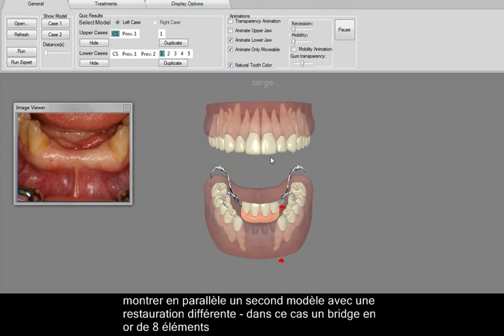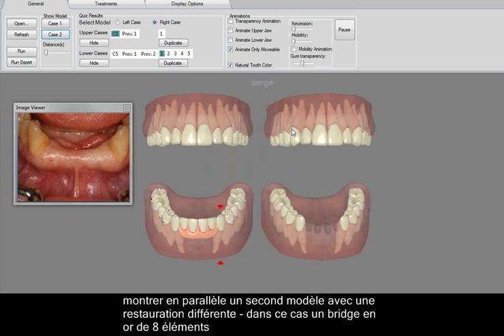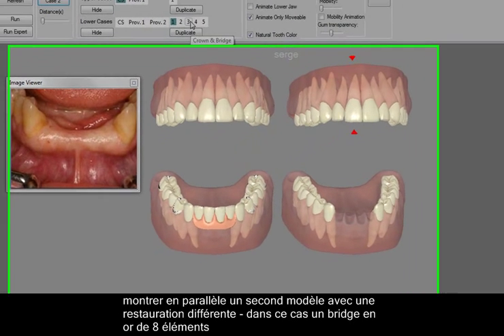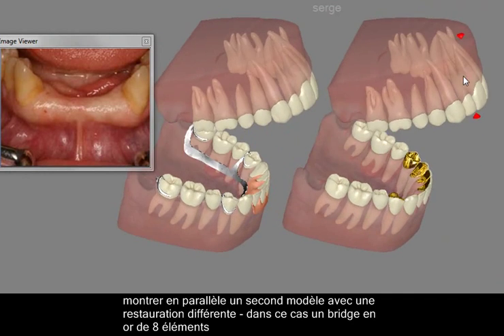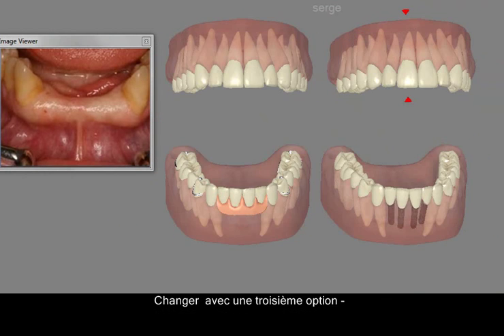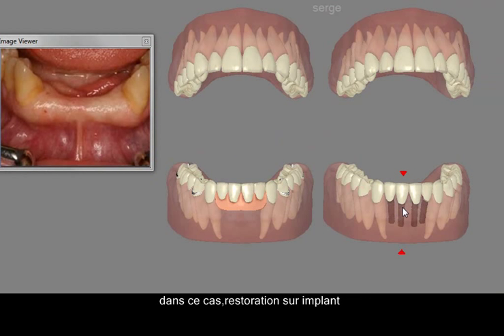Show a parallel second model with a different restoration — in this case, an 8-element gold bridge. Interchange with a third option — in this case, an implant.